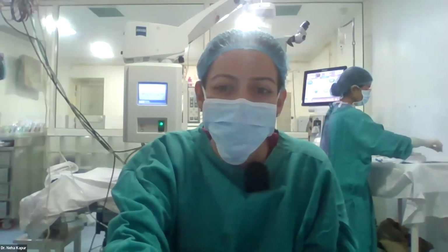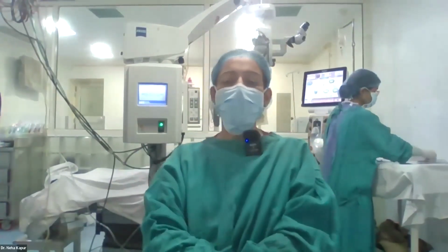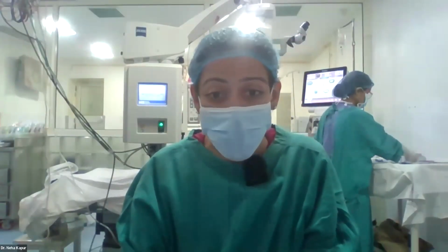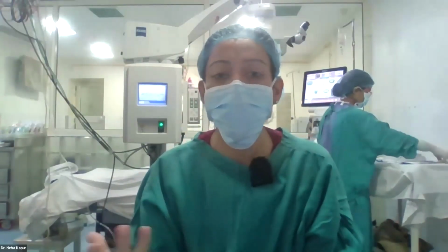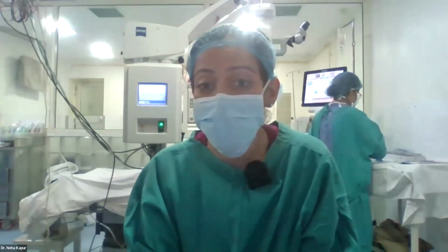Can we use non-expansile gas rather than air? So in patients with TRAB, we usually, as a first choice, don't do that. And giving them a longer airfill helps significantly. Non-expansile gas, however, does have a role.